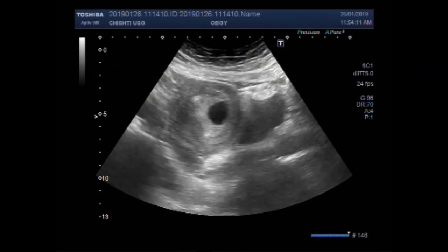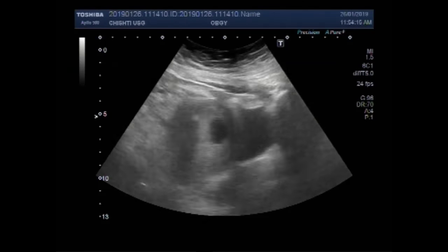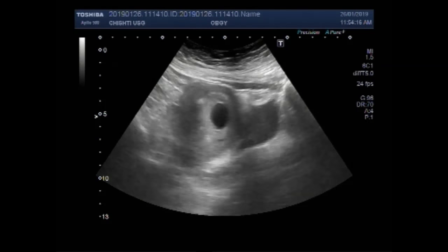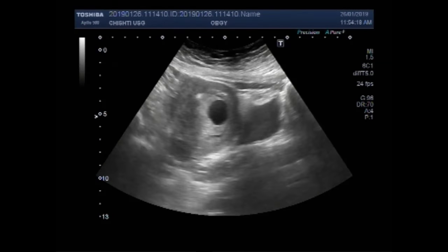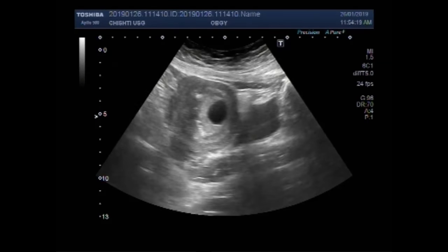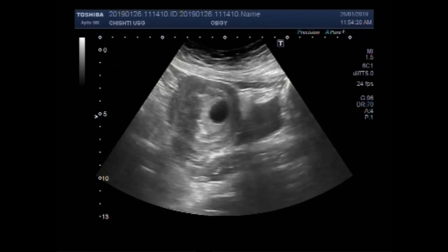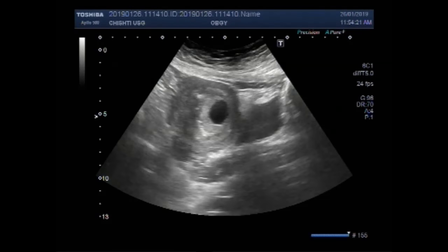Dear viewers, I hope you are all fine. This ultrasound video shows a gestational sac — a single gestational sac in the uterus — having no fetal pole in it.